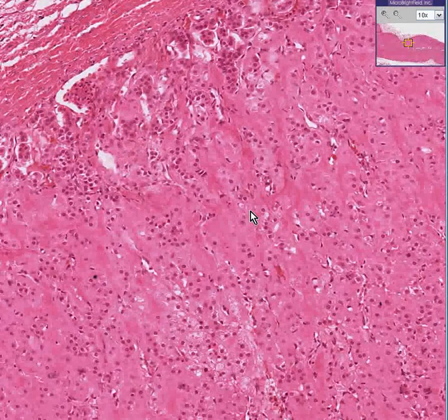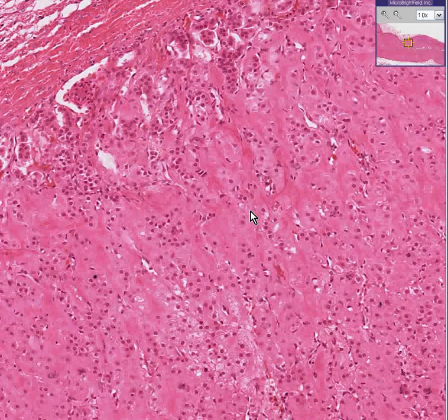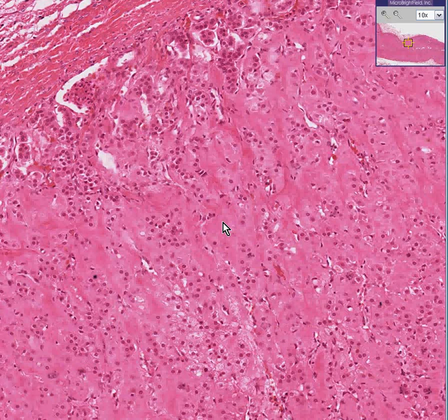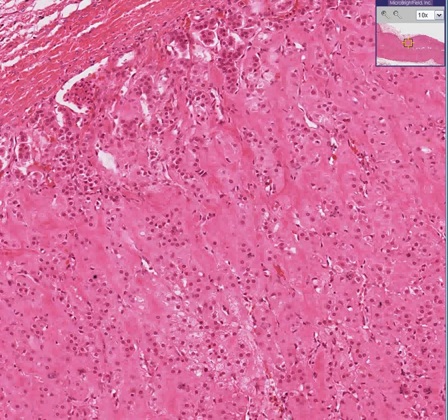This is amyloidosis of the adrenal gland. Amyloidosis can occur in just about any organ — in this case, it happens to be the adrenal. Thank you very much.